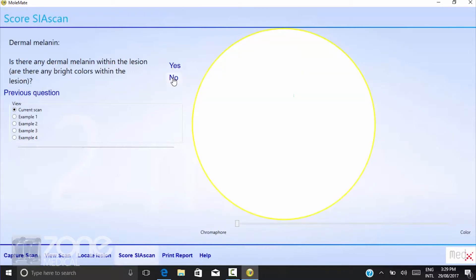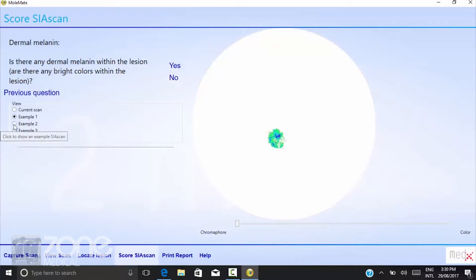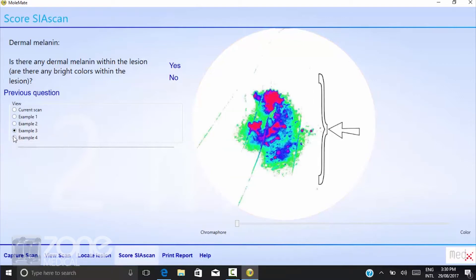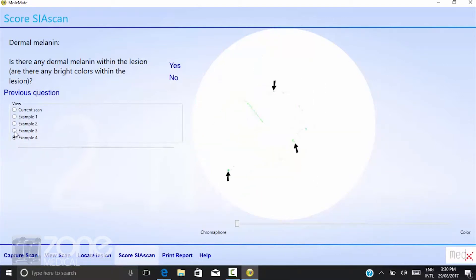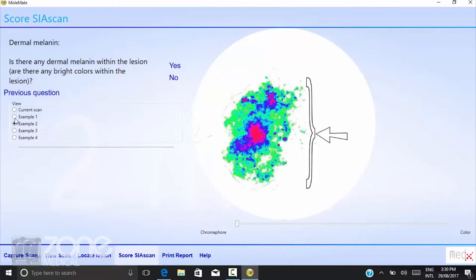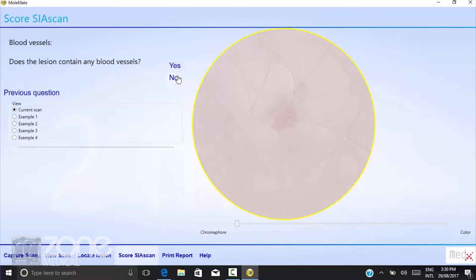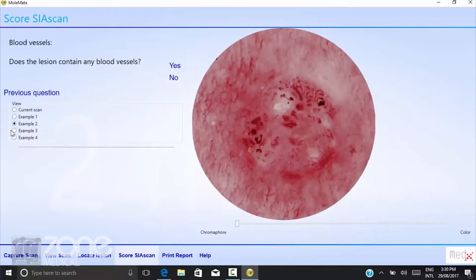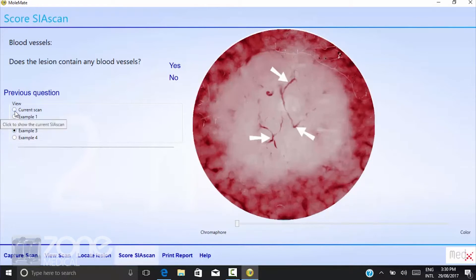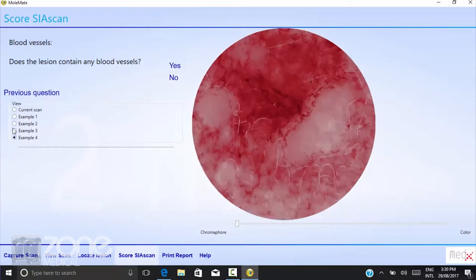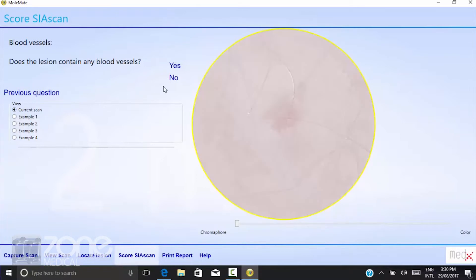Is there any dermal melanin within the lesion? Are there any bright colours within the lesion? We're looking for a very fluorescent bright pattern of reds, blues, and greens in this case. Once again, no. You just continue throughout these questions, which will essentially hold your hand through the diagnosis of any lesion you may need additional help with.